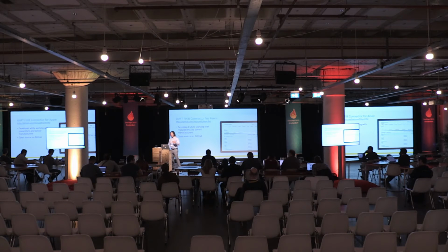Some of the important lessons that we learned, which Dustin went over a little bit, was devices sometimes send data at high frequency. And it's not necessarily streams, they might just send data at frequent intervals. The other thing is, it sends these payloads with mixed measurements. So you might have a heart rate monitor that also sends up blood oxygen or perfusion index all in one payload. So you need a way to separate out those measurements and then create FHIR resources that represent those measurements.